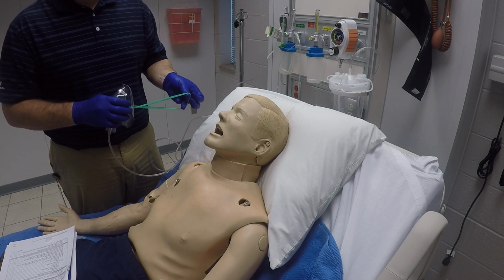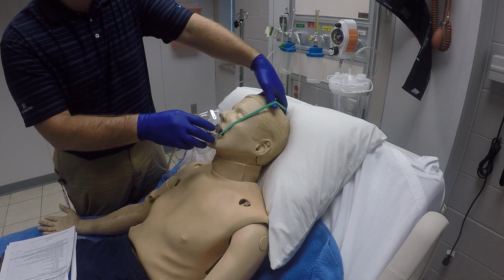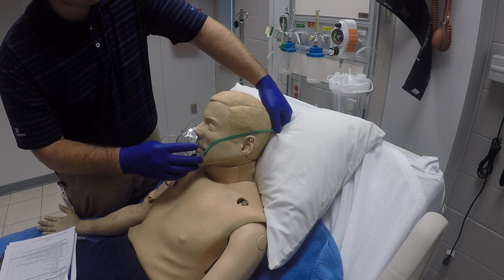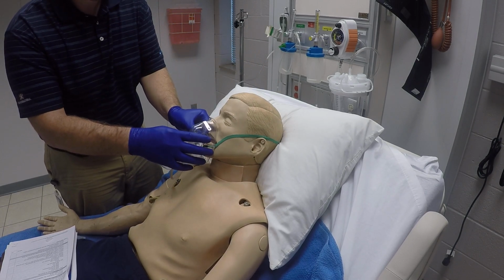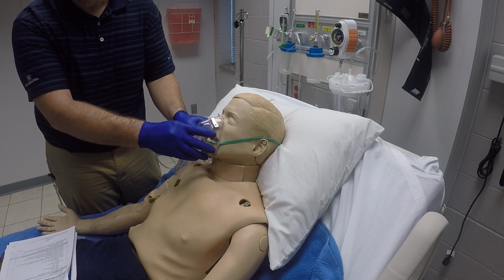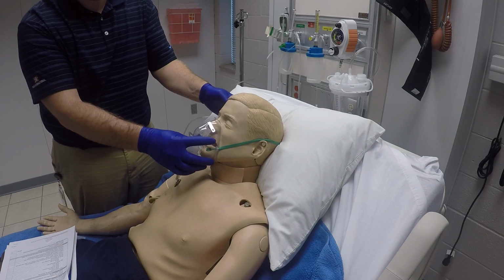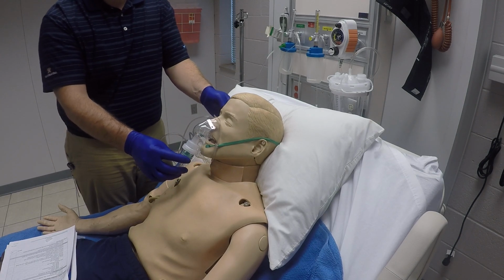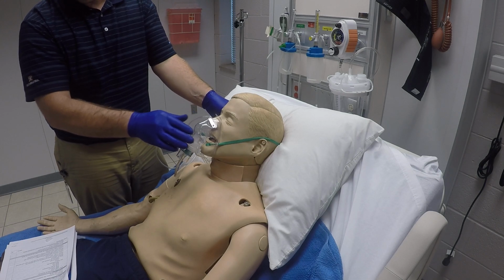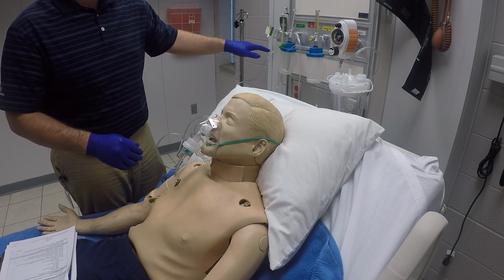We can go ahead and, as we're doing it, we can be coaching the patient as well to make sure that they do know how to take the medication and how to breathe during this. Instructing them to take nice, deep, full breaths best they can during this whole process. And usually you're taking at least 10 minutes or so to give this medication. So once that's on, we have our flow rate checked and everything.